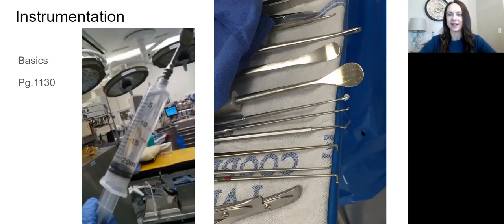Looking at this instrument right here, I hope that this is familiar to you. If not, I will point it out because it's not in neurosurgery in your orange book. So I believe we learned this in ENT, but that one is called a Woodson. So a Woodson elevator, sometimes people call it, but it is a Woodson. It's a stick handheld instrument, so kind of similar to all of your Penfields that you will see on page 1131. So similar, but has multiple functions. So with this Woodson elevator, you'll read in your book about things called a dural elevator. This can be used for exactly that. It can be used as a dural separator or elevator.